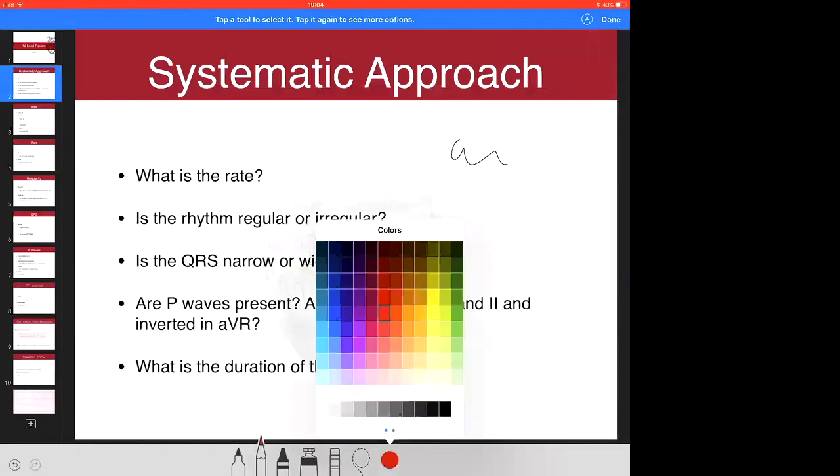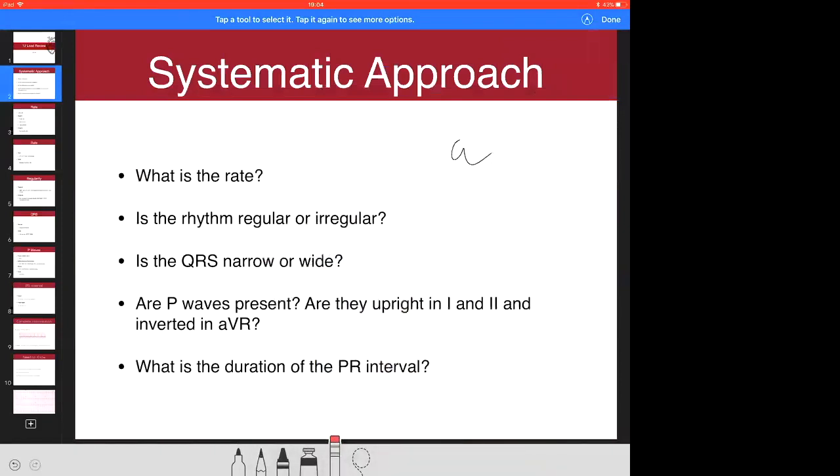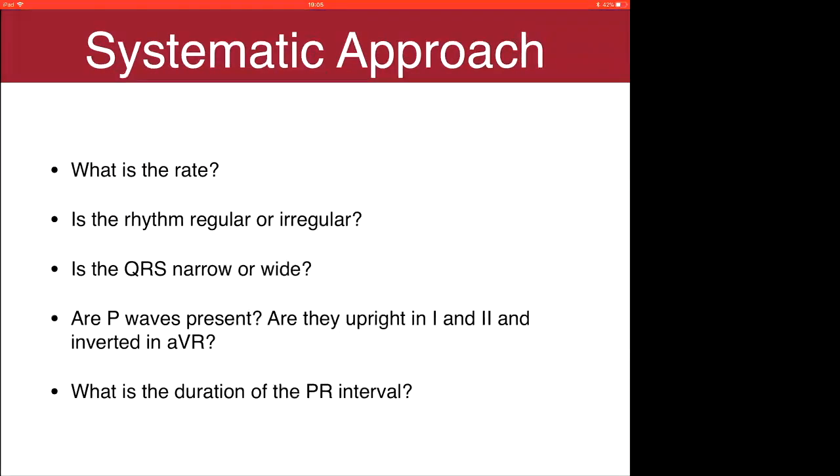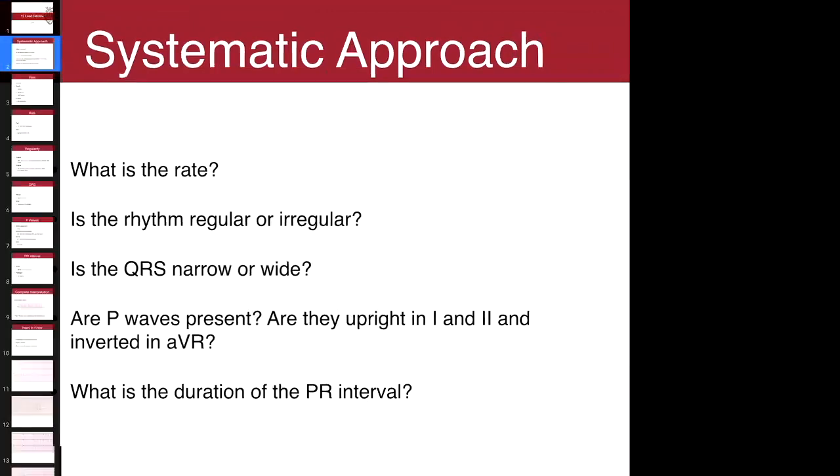Fantastic. Okay, I'm not sure what you guys were really looking for tonight, so I'm just going to do a general review on what the systematic approach to looking at these EKGs should be, and then I can walk you through practicing some of those if you want, and we can take it from there. So does that sound okay? Yes. If you need something else, let me know, and we can try to figure out how to make that happen here.